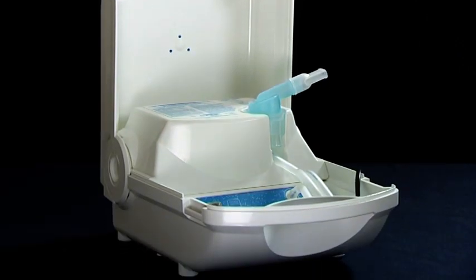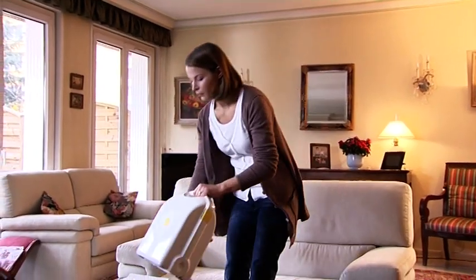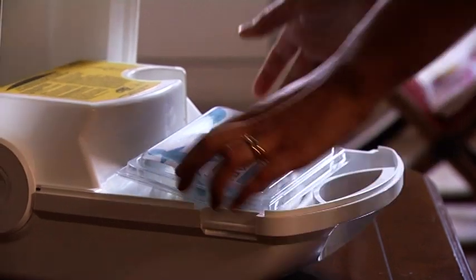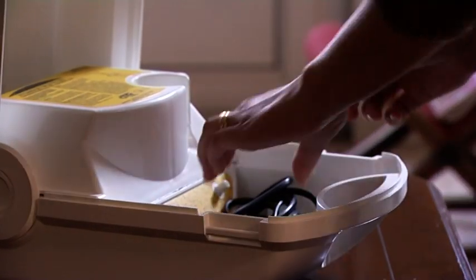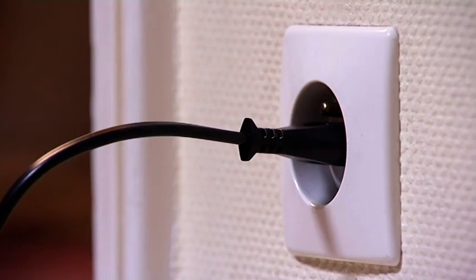Your session shall last 5 to 15 minutes, depending on your breathing and on the amount of medicine you have been prescribed. After having thoroughly washed your hands, put the device on a table. Open it and take out the nebulizing kit. Plug the unit in.